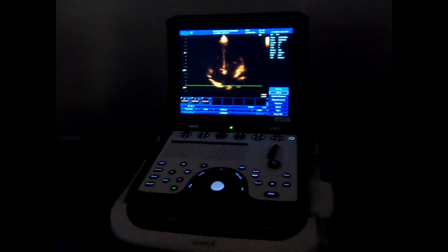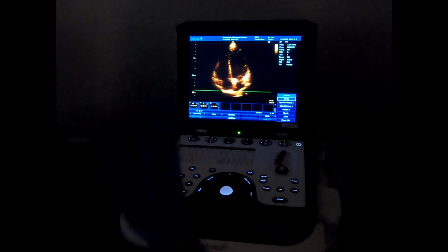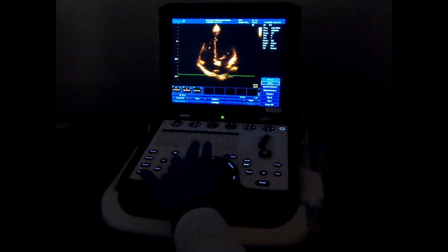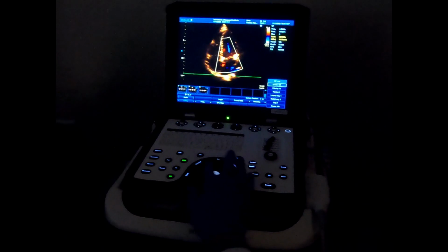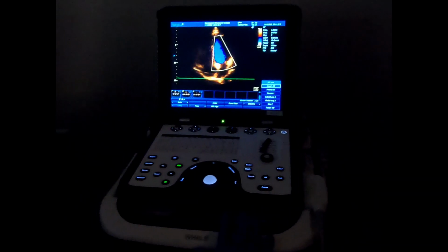That's a good question. Okay, I know, but the deceleration slope has deceleration time within it. Okay, that makes sense. So is it still a slope measurement when we're measuring that? Yes, you need to measure a slope, giving you the time, not the slope. Okay, I just wanna make sure, I got confused with that.